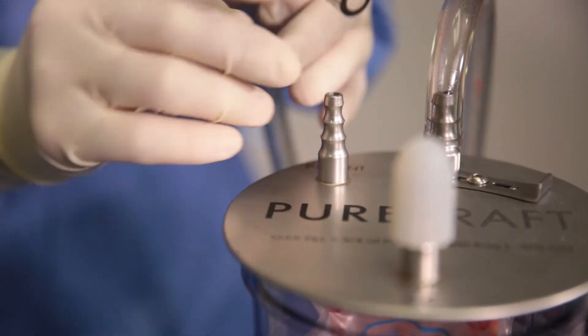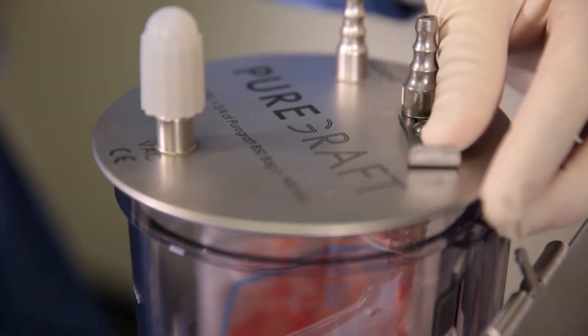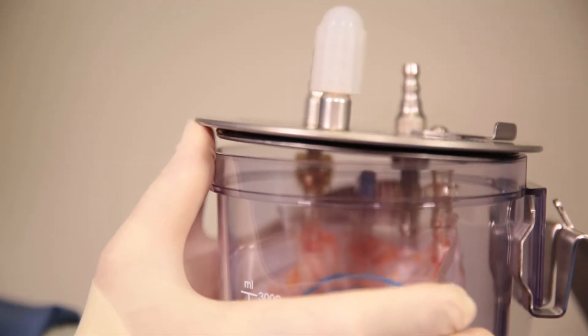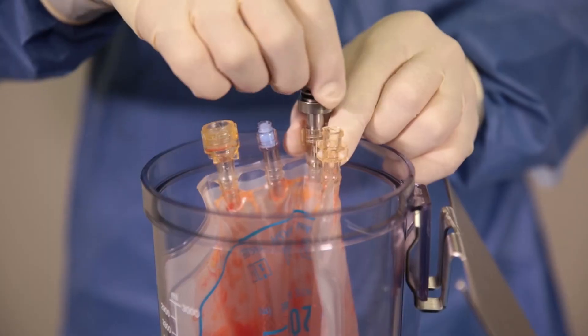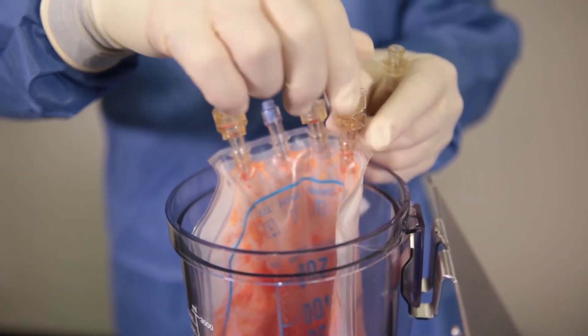To remove the bag from the canister, first unlock the fitting on top of the lid and then, utilizing both thumbs, release the lid from the canister. Now, unscrew and remove the drain port. Before lifting the bag from the canister, reattach the aux cap.